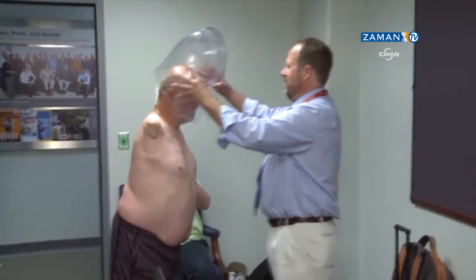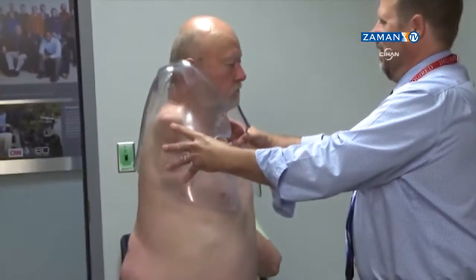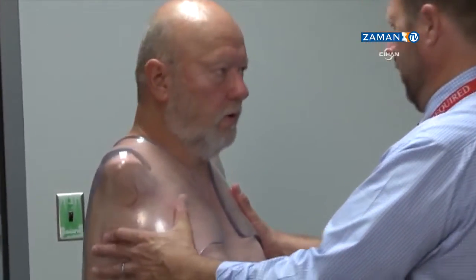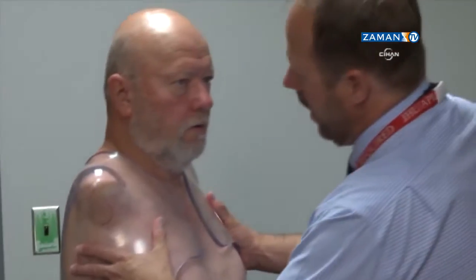On this day, Les is being fitted for his socket, which is a body brace that makes the neural connections with the re-innervated nerves, as well as supports the prosthetic limbs.